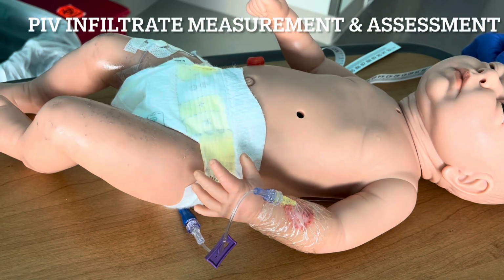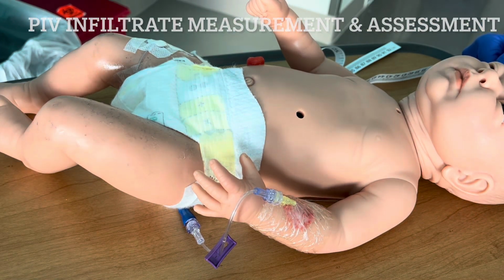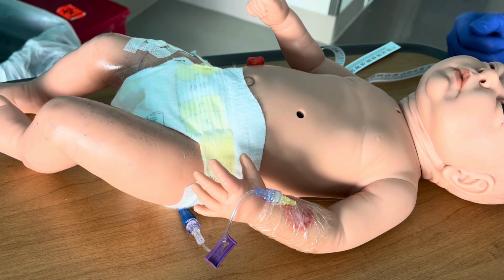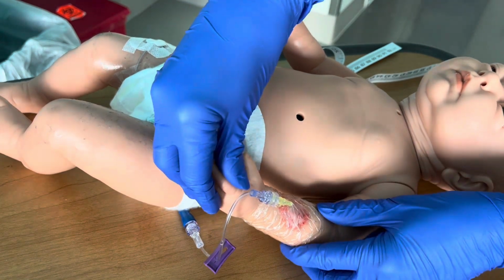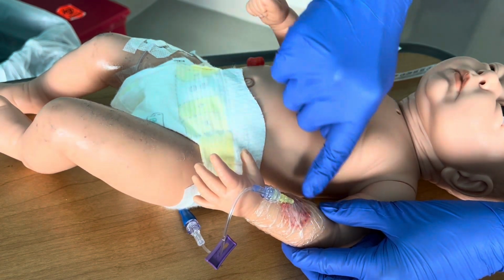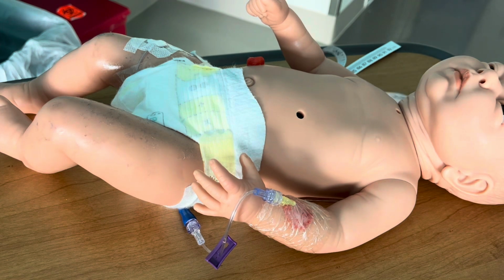Hi, the purpose of this video is to demonstrate infiltrate scoring, measurement, and documentation for PIV infiltrates. So the first thing we're going to do is show you how to do the correct measurement for a PIV infiltrate, and we'll talk about scoring and how to document.